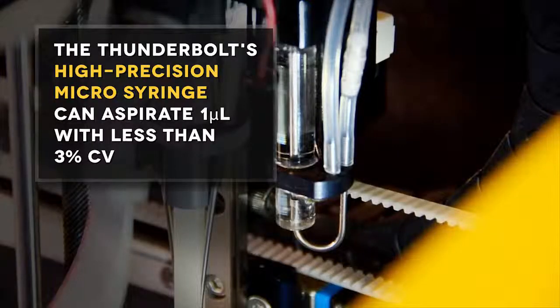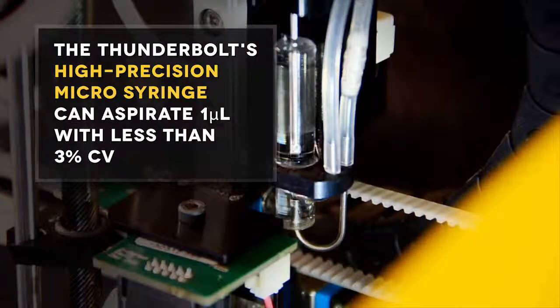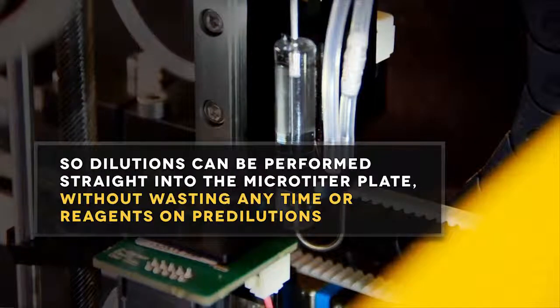The Thunderbolt's high-precision microsyringe can aspirate 1 microliter with less than 3% CV, so dilutions can be performed straight into the microtiter plate without wasting any time or reagents on pre-dilutions.